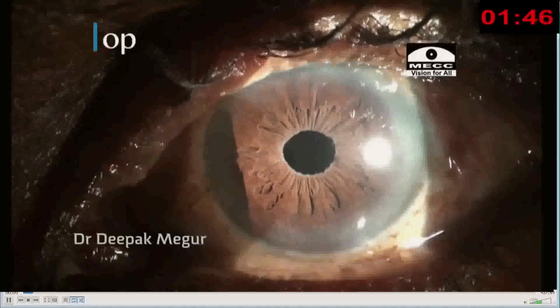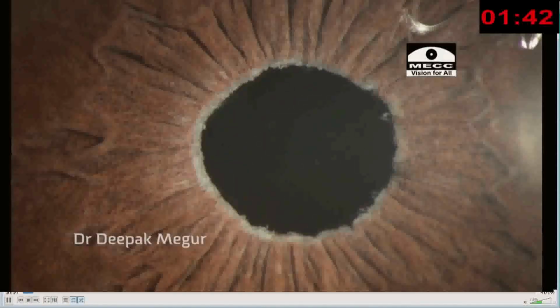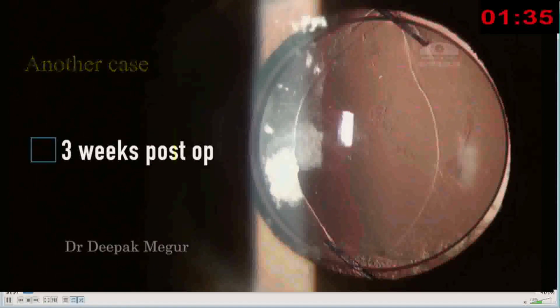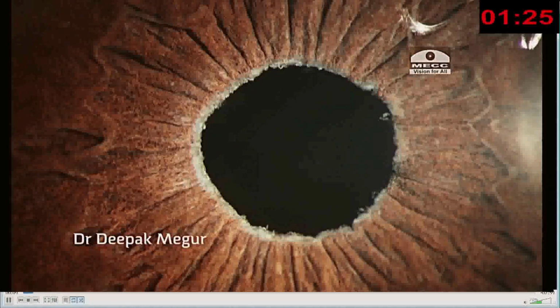Now these are some of the pictures which are taken post-op over a prolonged period of time. Well, I was surprised by the long-term stability and centration of these lenses. Of course, my longest follow-up has been 5 years, which is not long enough in such eyes with pseudoexfoliation because it might still decenter or dislocate later on. But at least the initial results have been quite encouraging.